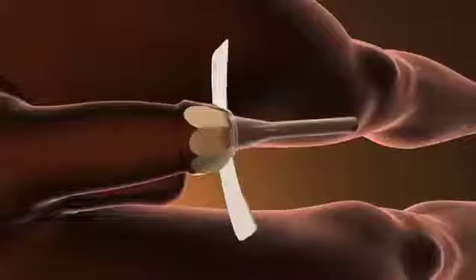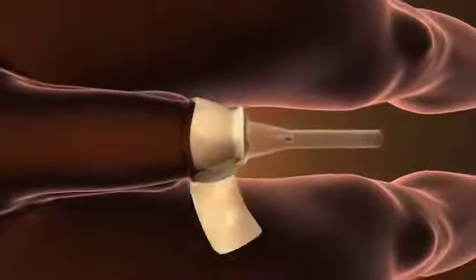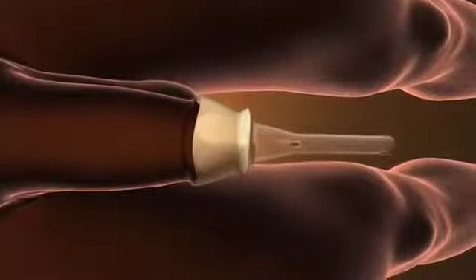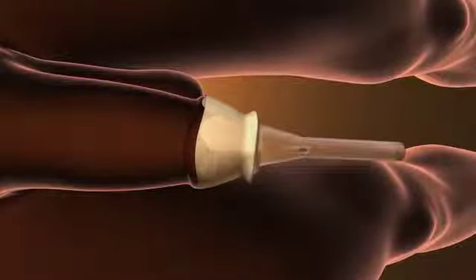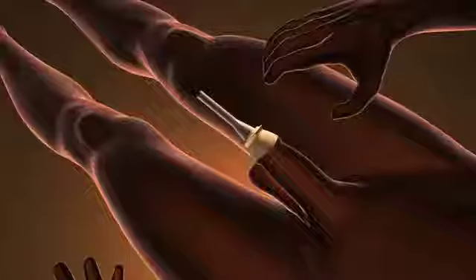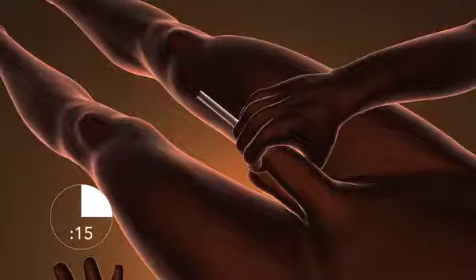Step 4. Next, apply the wings around the head of the penis by wrapping one wing at a time around the tip of the penis flat and wrinkle-free. Be sure that the wings cover all openings between the petals to prevent any possible leaking. Apply gentle pressure and hold for 10 to 15 seconds to ensure a strong seal.